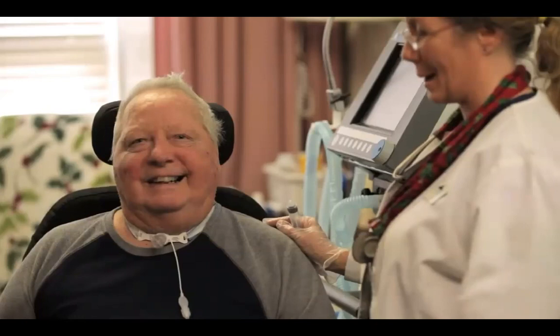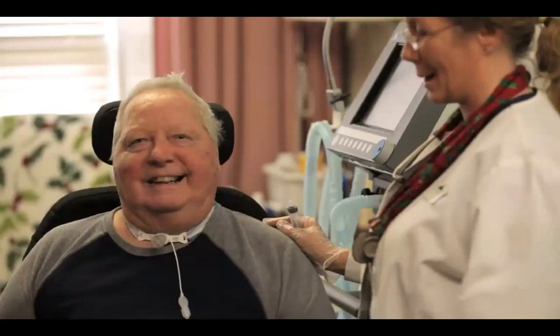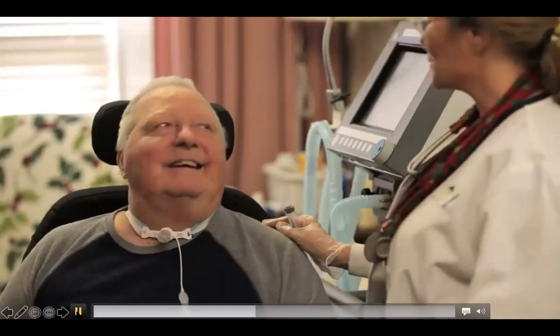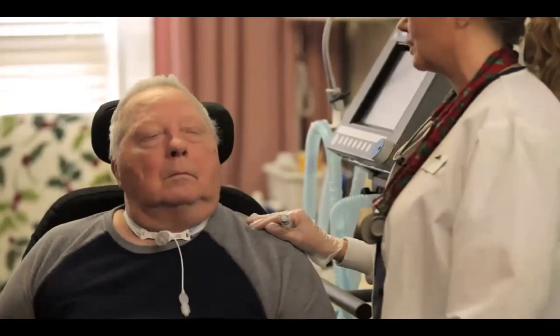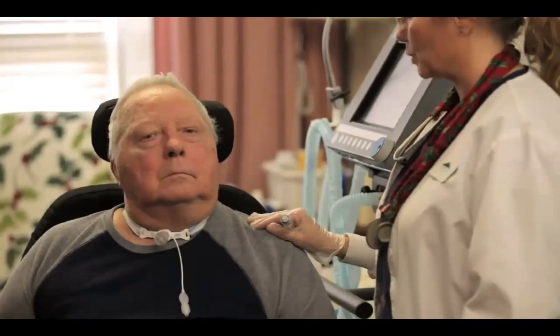So you need to monitor him over the next few days and see if there's improvement in his vocal quality. And if in a week or two no improvement, then you need to question if this patient is having any vocal folds issues or paralysis or something. So you might refer to an ENT to check his vocal folds. The other benefits of this valve is to help you be able to eat and drink and taste and smell and have a better way to communicate with people.